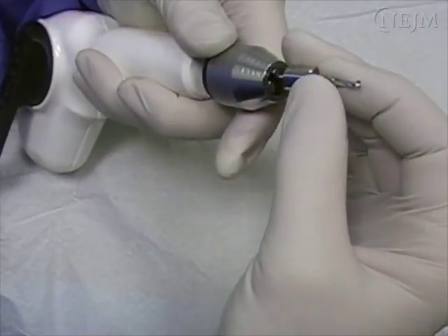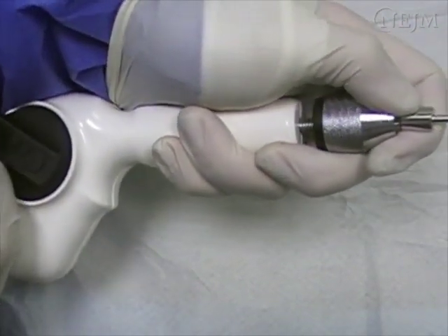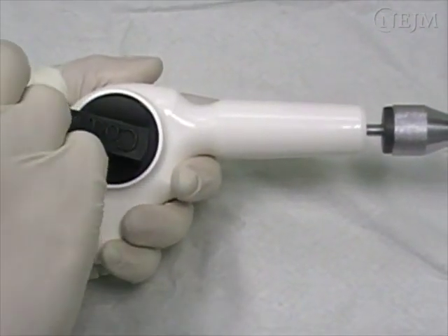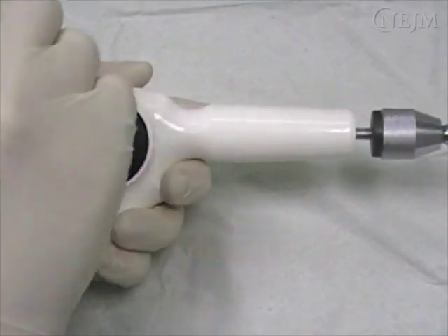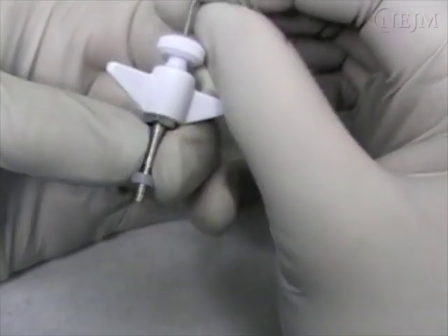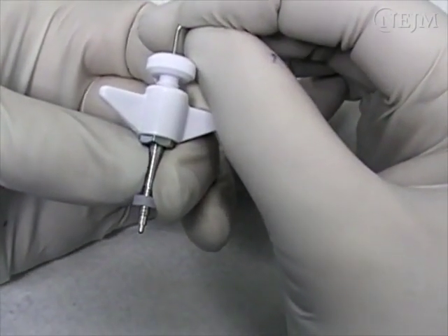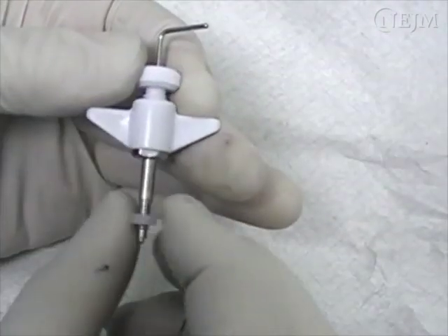Prepare the autoclave twist drill by placing the bit into the chuck, holding the drill handle in place, and then turning the chuck clockwise. Prepare the bolt by placing the stylet in the lumen with the tip exposed. In most adult patients, the spacing washer is unnecessary and may be discarded.